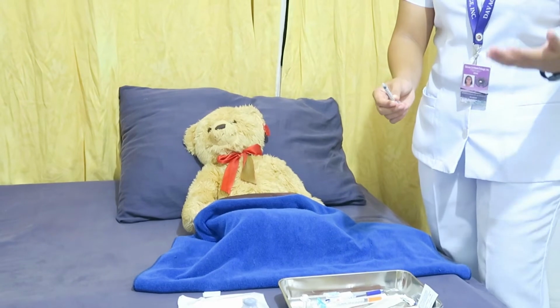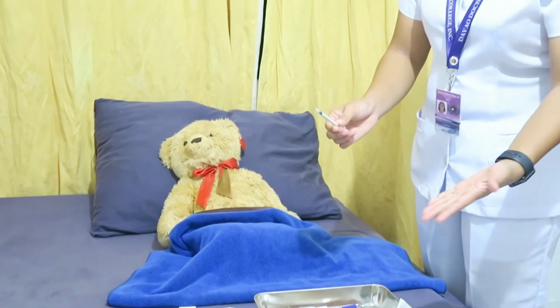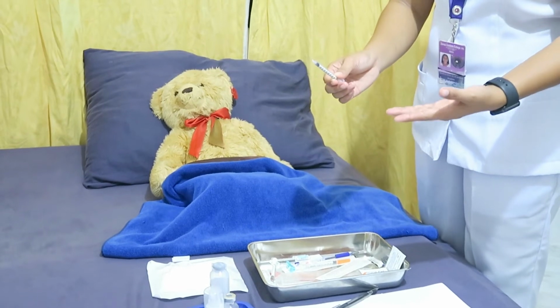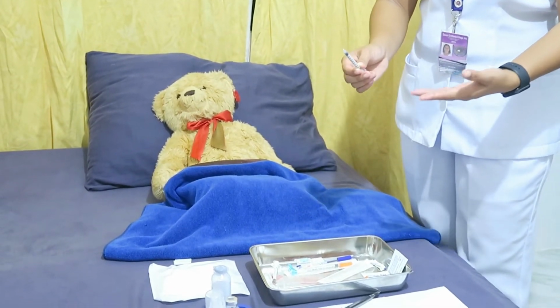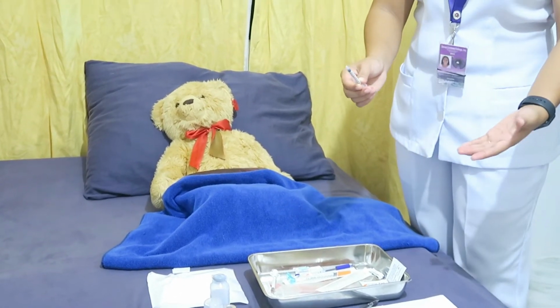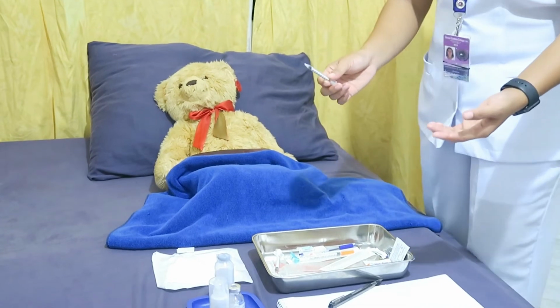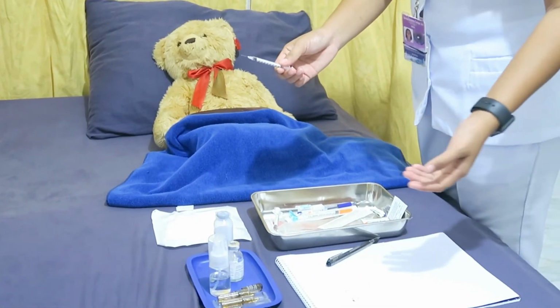So, when the needle is inserted, move your non-dominant hand to the end of the plunger. Some nurses find it easier to move the non-dominant hand to the barrel of the syringe and the dominant hand to the end of the plunger. The rationale for that procedure is to have an efficient push to inject the medication. Then, inject the medication by holding the syringe steady and pressing the plunger with a slow, even pressure.